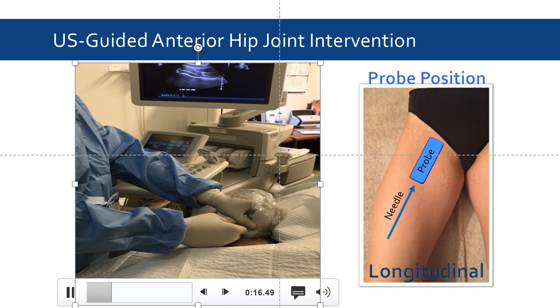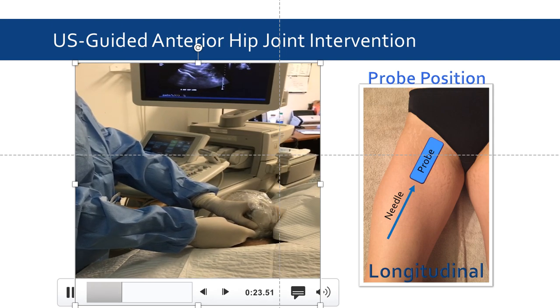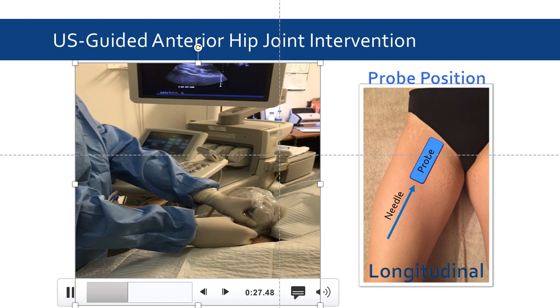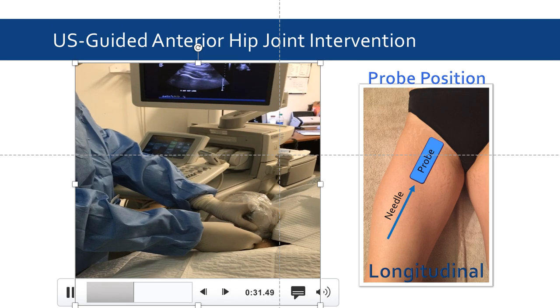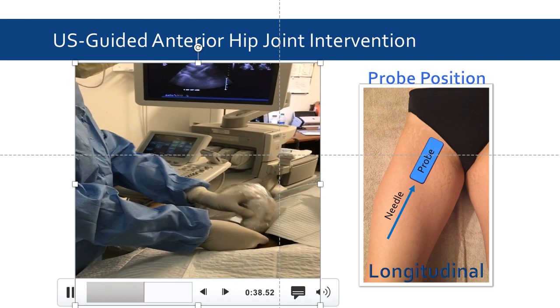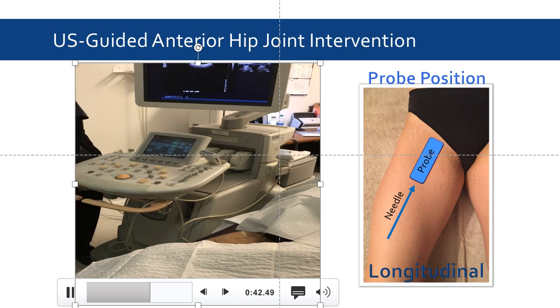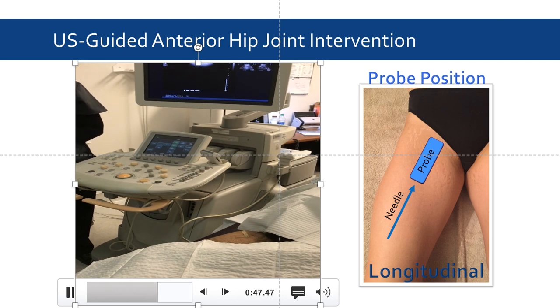There's our echogenic needle coming down. We've hit the bone, which is our landmark. Keep that sterile just in case. I'm just going to get some fluid out and see if we can aspirate.